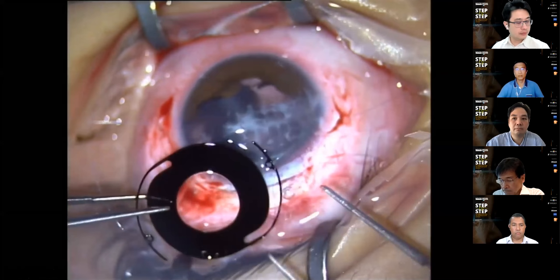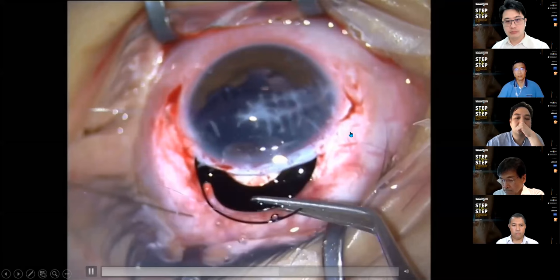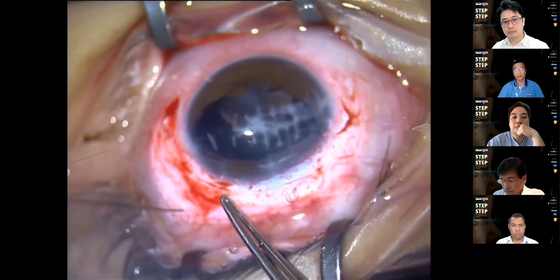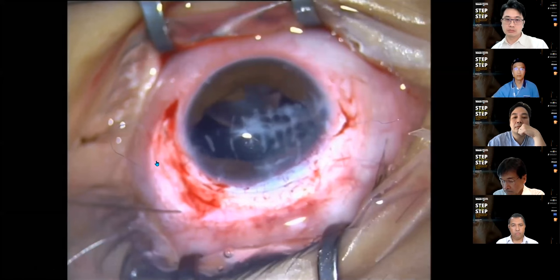So what you do is, this part will be the leading haptic, and make sure that it is as short as possible so that it doesn't tangle inside the eye. As you push in, you can pull gently into the eye and it will rotate and go here. So the leading haptic will go to the right flap, and this will go to the left flap. And you can now center the IOL, looks like a part of the iris here.